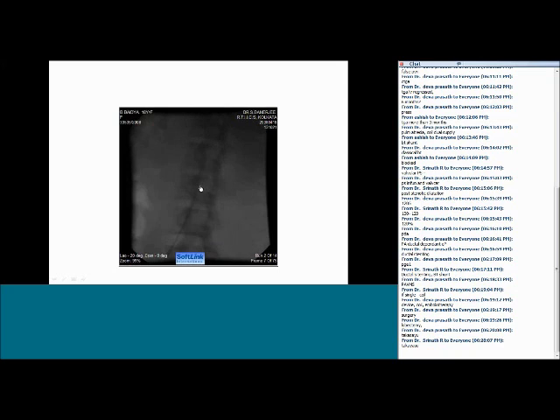Then when she went for the pre-surgical echo and examination, it was found that the patient doesn't have a proper pedal pulse. And then a detailed echo and Doppler of the descending aorta showed that there is diffuse narrowing of the descending aorta.